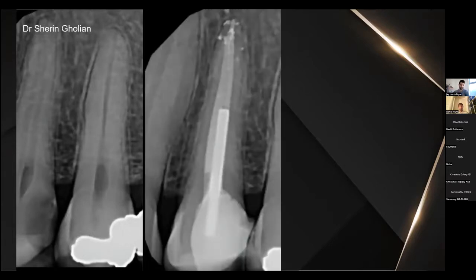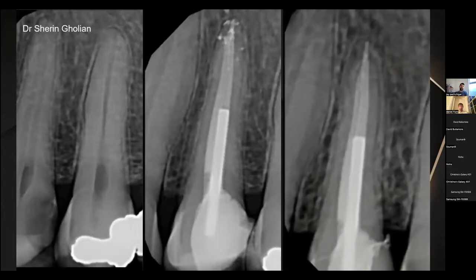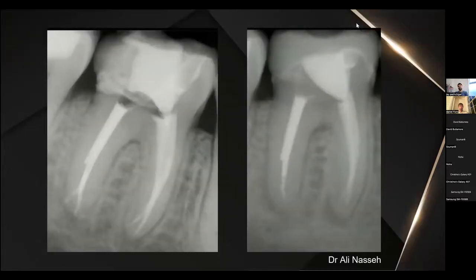So again, the guy's done a warm vertical, picked up some nice anatomy over there, and at his follow-up, that apical delta, or the sealer which was pushed into that area, has resorbed over time. And on a case like this, it's made no difference. The tooth is still asymptomatic.